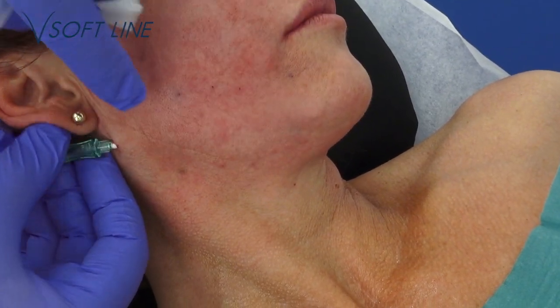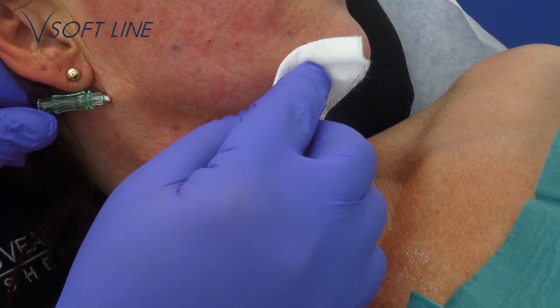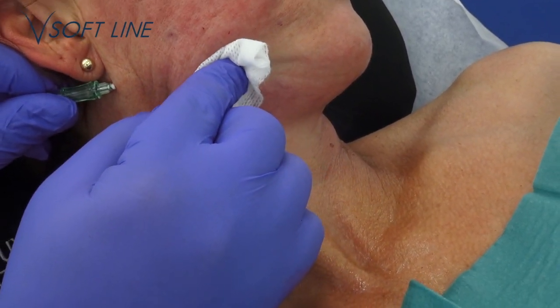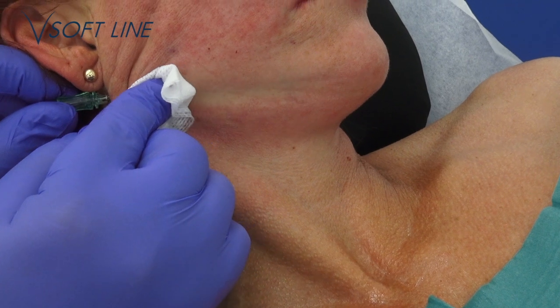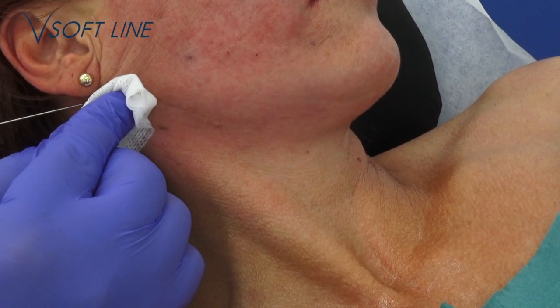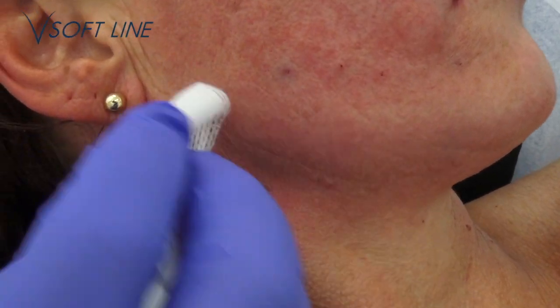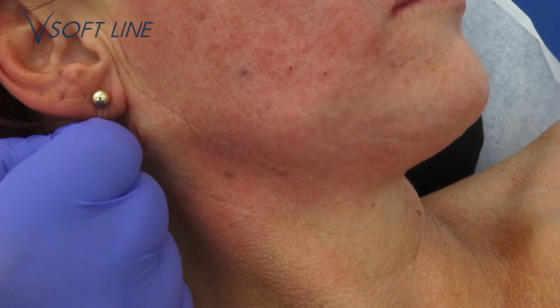All the way along, make sure that it follows the jawline. Support with your fingers. Stretch the tissue strongly, and then withdraw the cannula and release. Now you can see the immediate lifting effect, nicely placed right here. Barbed blunt cannula L 21G 90mm.